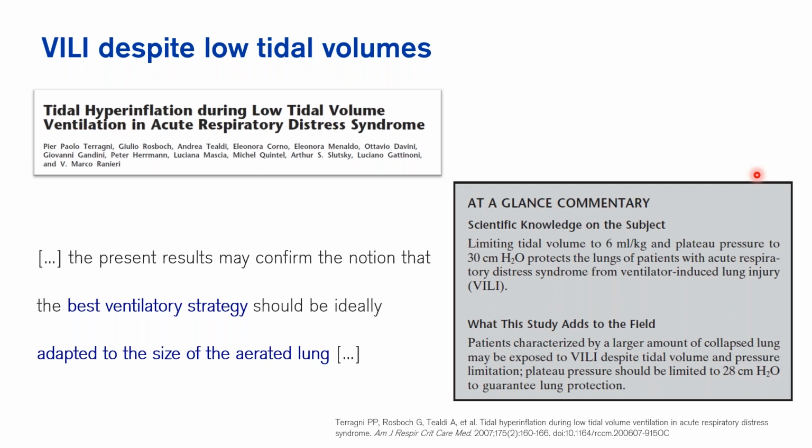And these are suitable parameters for a majority of patients to protect the lung from the development of ventilator-induced lung injury and potentially the development of ARDS.